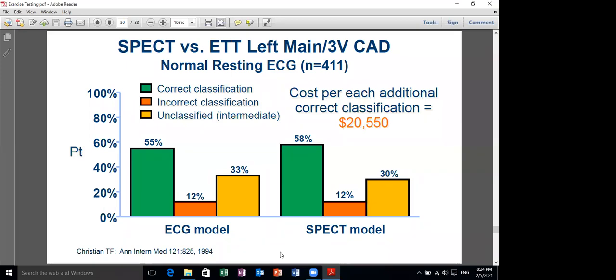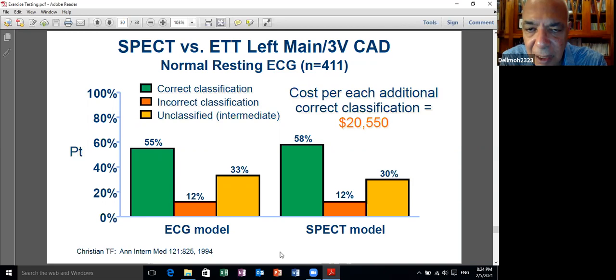اللي بتحصل. نمرة 2 ان الليفت باندل is very frequently associated with significant repolarization abnormality. Logic. ليه؟ لانك انت activating muscle to muscle conduction in a big mass of the heart اللي هو left ventricle, so repolarization will be grossly abnormal. So this obviates انك تستخدمي ان exercise ECG test في الدياجنوزس بتاع الليفت باندل.